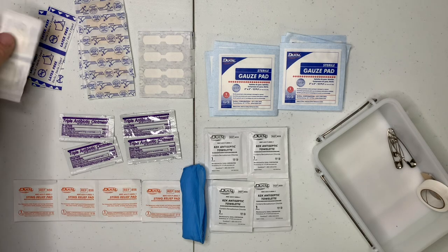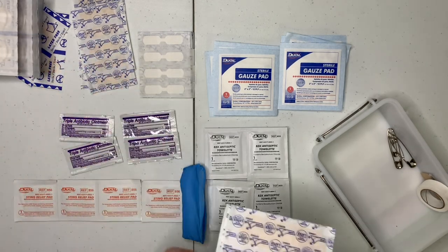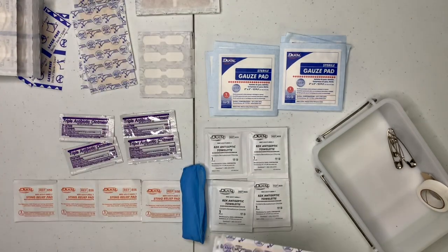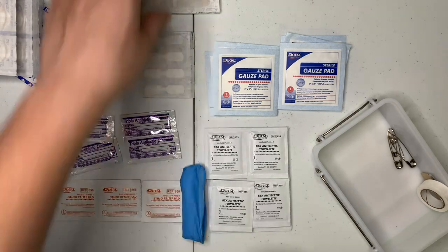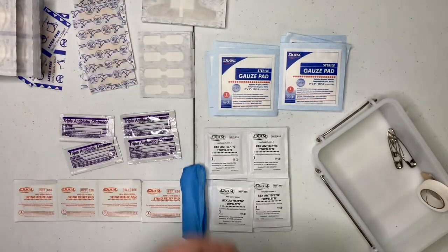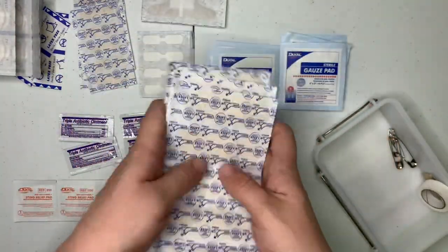Then you got your little bandages. You got your dot bandages, your slit bandages, your butterfly bandages. Then you got your larger strip bandages — closure bandages, or knuckle bandages, I think that's what they're called. Then you got a whole bunch of bigger bandages.